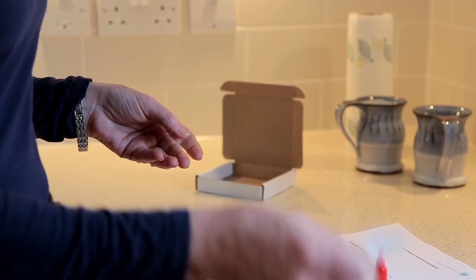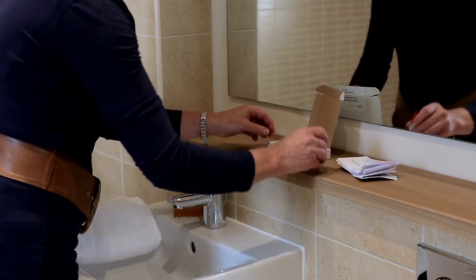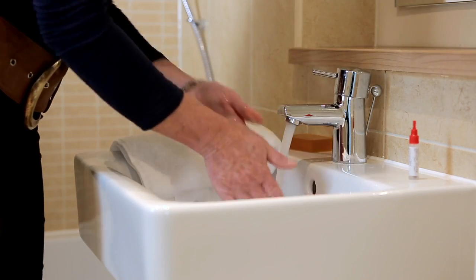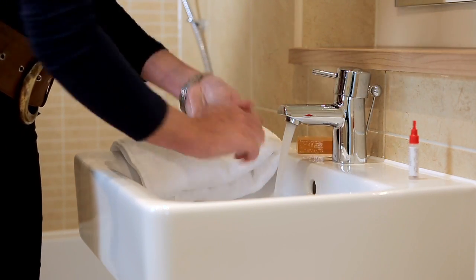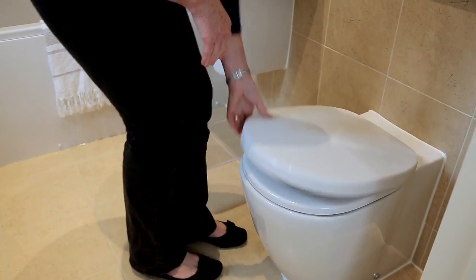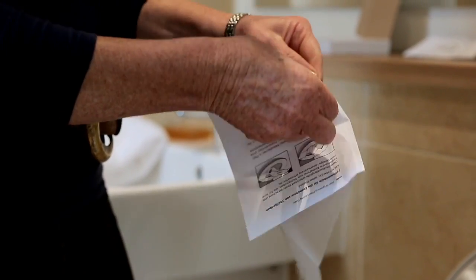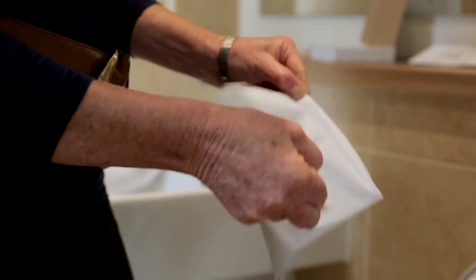Now you are ready to do the test. All you need is the contents of your kit close at hand and to be ready for a bowel movement. When you are ready for a bowel movement go to the bathroom, wash your hands and get everything nearby before going to the toilet. The test is not complicated, it is quick and hygienic. Lift the toilet lid and seat then open out the stool catcher which is the folded piece of paper. Once in place this will prevent your stool from dropping into the toilet bowl.